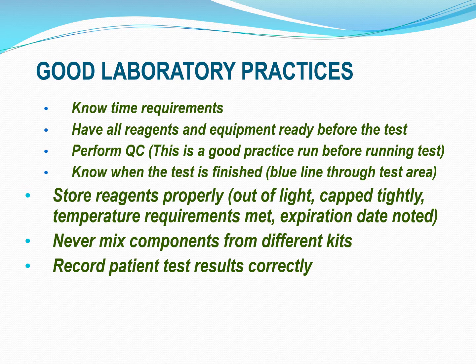What should happen is, on your negative control, you should get a negative result, but you should also get a line that shows that internal QC is working as well. So you may only have one line on the negative one, because that one line is just where your internal QC is. Then on the positive control you ran, it will have a positive mark showing that the test is positive. And also, the internal control line will be there, so you may have two things showing up on that. Now, once you've run it on that kit, a lot of kits, that's all you have to do.